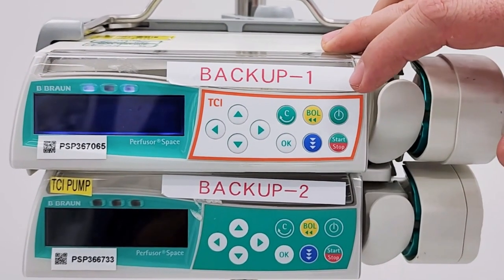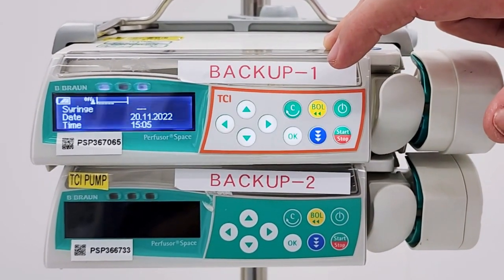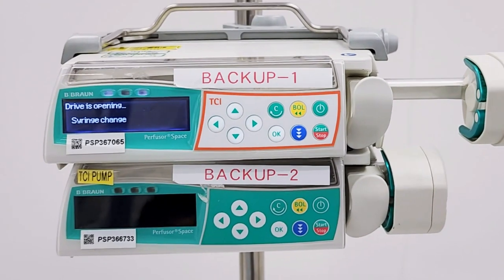Press the power button to switch on the unit. The automatic self-check will get initiated. After the self-test, the drive will move backward.